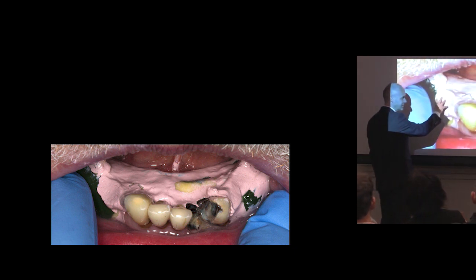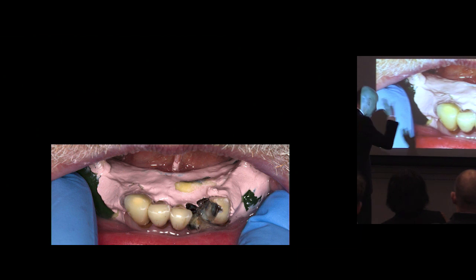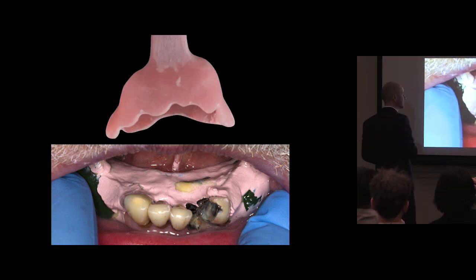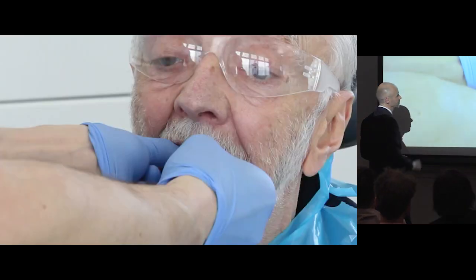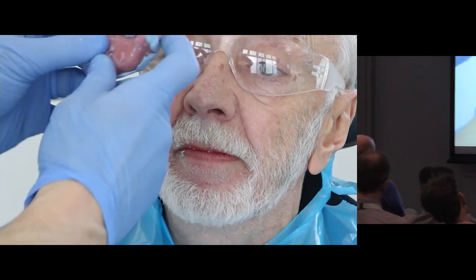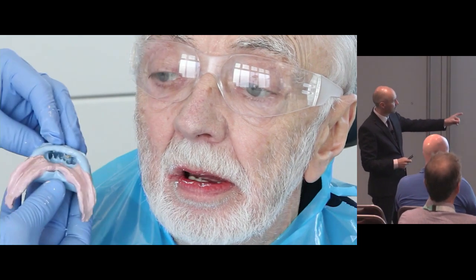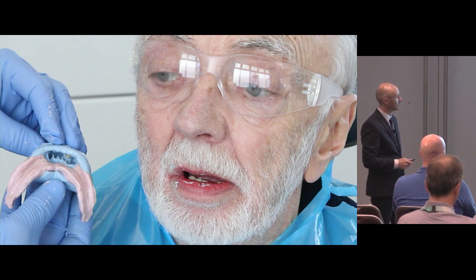Impression in, it just sits on these back edges of the teeth. You know, that's it there, it's just in place. And then I just fill up that with alginate over the top, like that, and then take this out. So, it comes out together like this, all in one. And then Rowan really skillfully replicates that in the final denture.